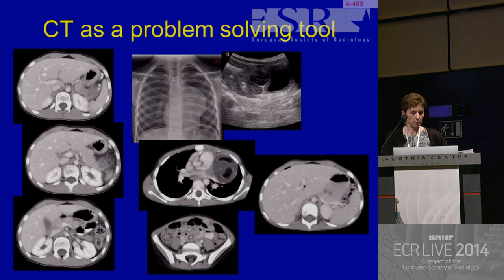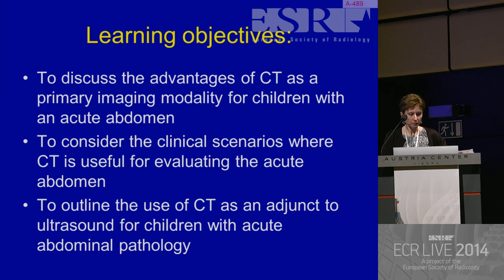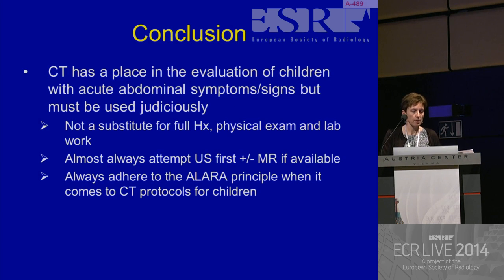imaging to do that. I'm going to skip my problem solving and just go back and reiterate my learning objectives. I hope that I've shown you some of the advantages of using CT, particularly for those of you who don't work in a dedicated paediatric institution, and shown you some of the clinical scenarios where CT is useful and where we have used it when we've tried and failed with ultrasound. I think CT does have a place, but what I would stress again is that it's not a substitute for evaluating your patients clinically, and that we would generally try ultrasound, and if it's there, MR. And please, if you are going to CT, make sure your protocols are weight-based for the children and that you use as low a dose as possible. Thank you.